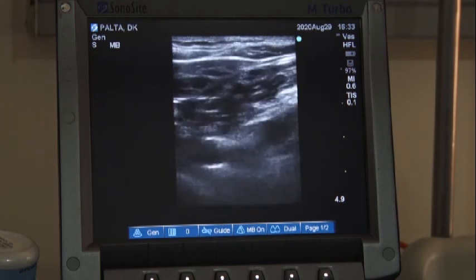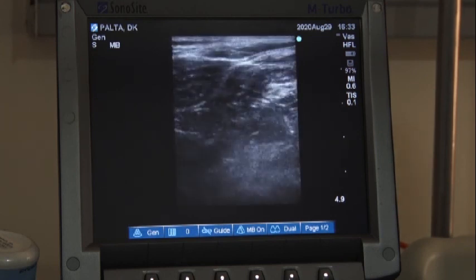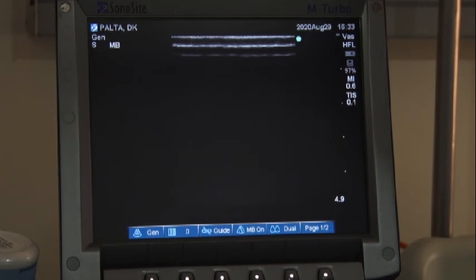So we have seen the fistula, we have screened the radial artery, proximal 4 centimeters, then we have seen the anastomosis, then the juxta-anastomotic segment at 1.5 to 2 centimeters, there is a branching accessory vein. The blood is taken by one vein, half of the blood is taken by another vein, and the third vein is there, the branch. It's a very small branch, not taking much of the blood.